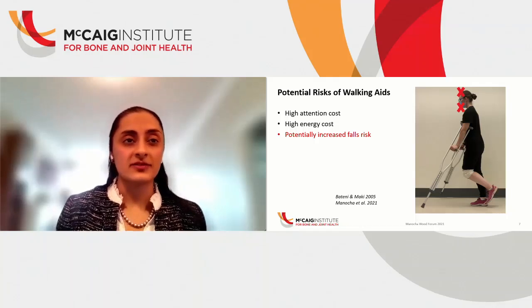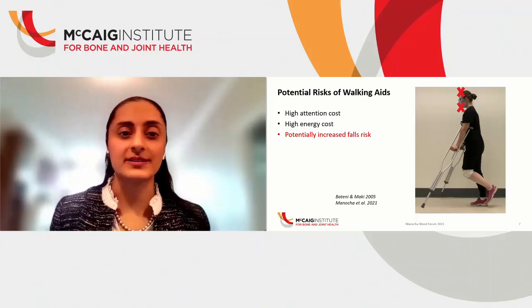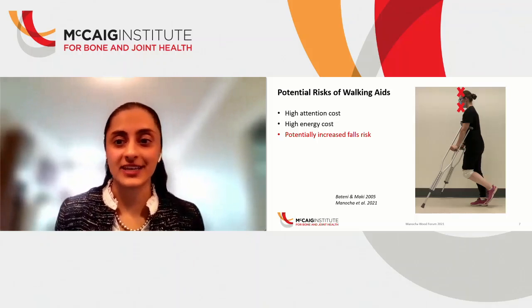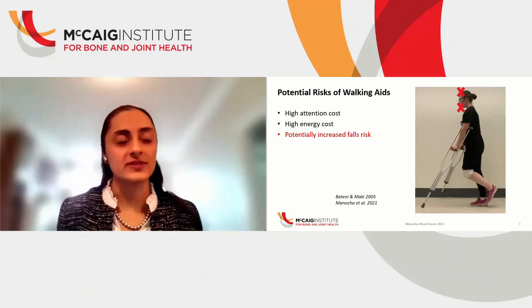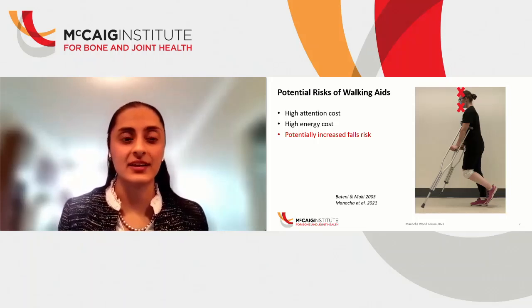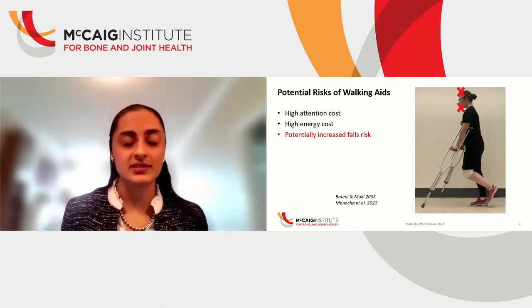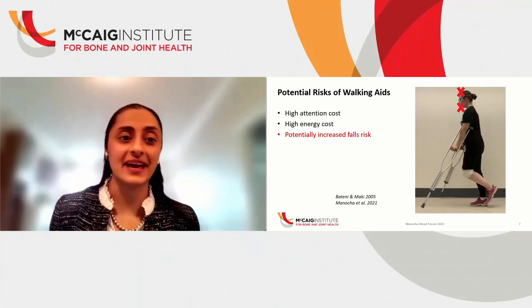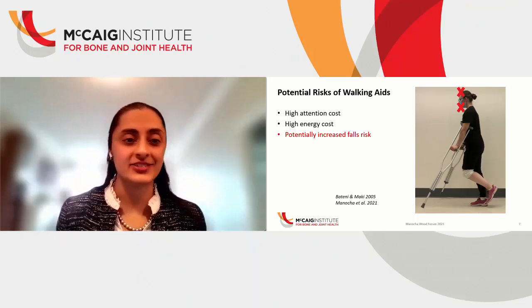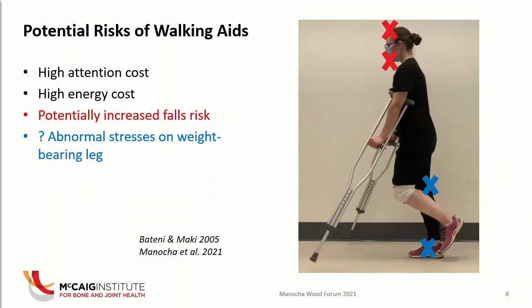Many studies have also shown that even though walking aids can improve our sensation of where things are in space, they can also increase the risk of falling. So that's through things like how it affects our attention. Sometimes when using canes or crutches, you're just making contact with the ground with a very fine point. So that can be a bit destabilizing. And some people will just trip over their walkers or their crutches. So this has been reported to lead to things like head injuries, dental fractures, skin lacerations, and sprains and strains.